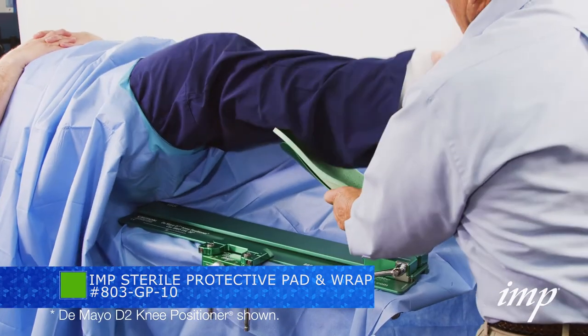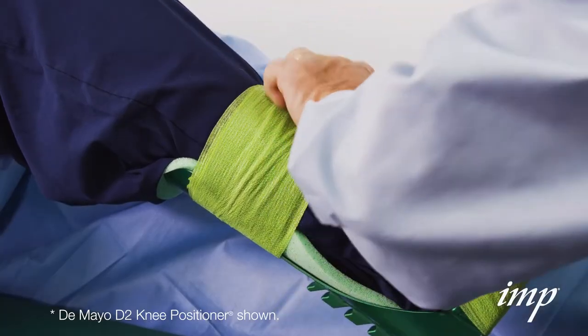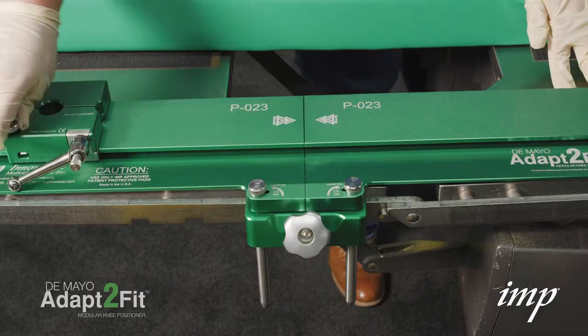Wrap a cohesive bandage around the foot starting with a minimum of six foot wraps. Tear and finish the wrap above the distractor block around the calf. Also note, do not wrap the cohesive bandage over the distractor block on the back of the boot.